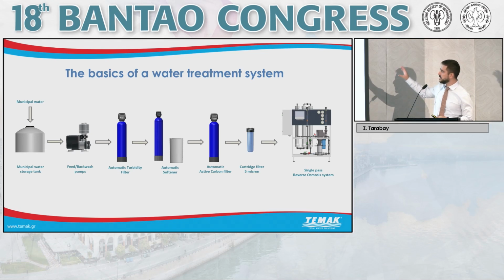The key step in the treatment process is the reverse osmosis, which basically filters out everything on an ionic level and above. So we're talking about microorganisms, bacteria, fungi, viruses, and of course it removes all the minerals and salts, essentially bringing it to the level required by the international standards for dialysis water. So one stream is the purified water and one stream is sent to drain. All the steps before, what we see is what we call the pre-treatment.